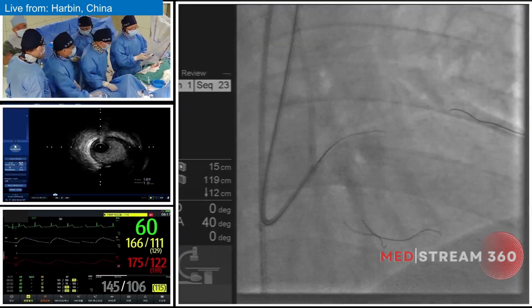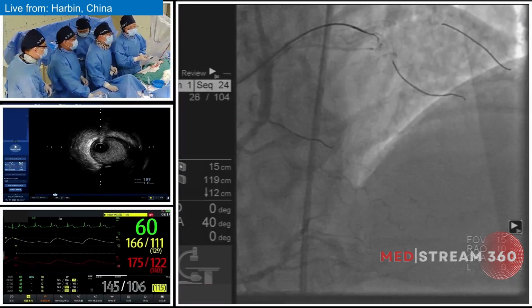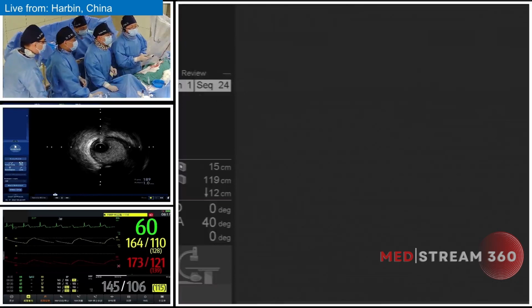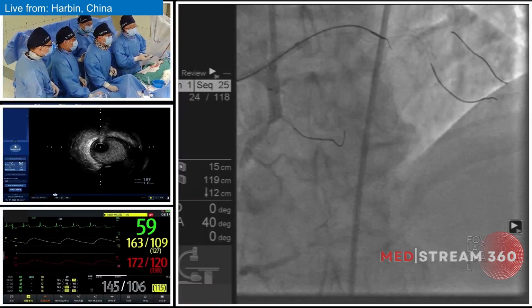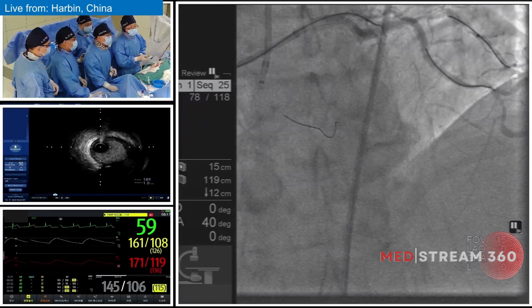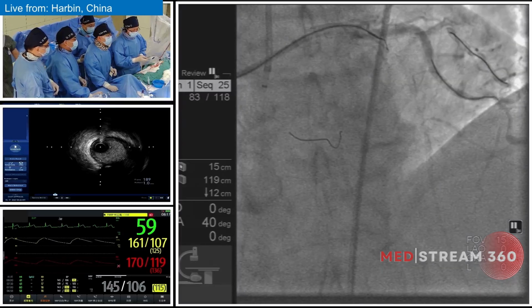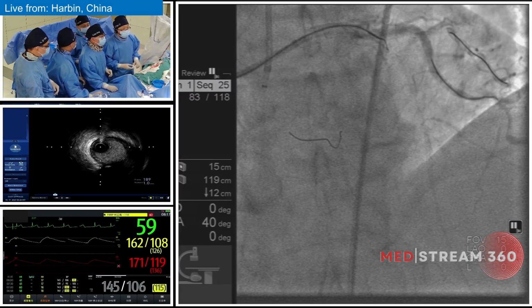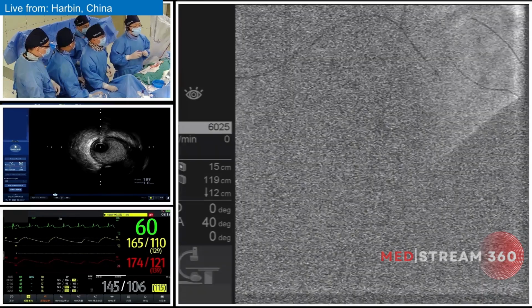Since then, we noticed that there are several questions involved in the antegrade approach. One question is what is the strategy of the antegrade wire escalation? First, we noticed that Professor Li used a Gaia Third wire and switched to a Conquest Pro, and later a Conquest Pro 12. Eventually we used the Conquest Pro 12 to engage the proximal cap of the CTO segment.